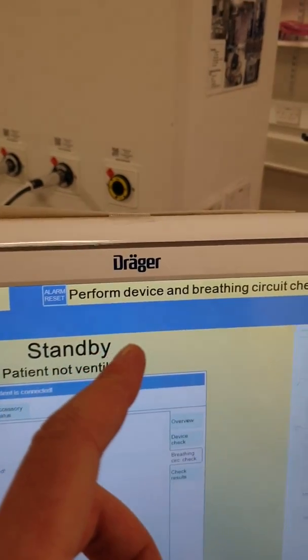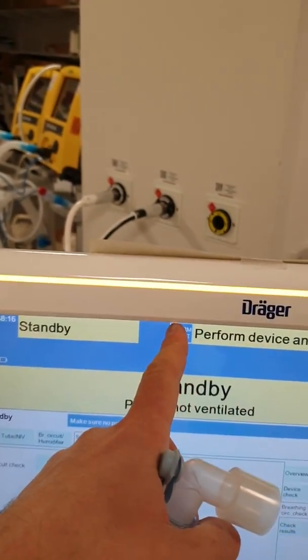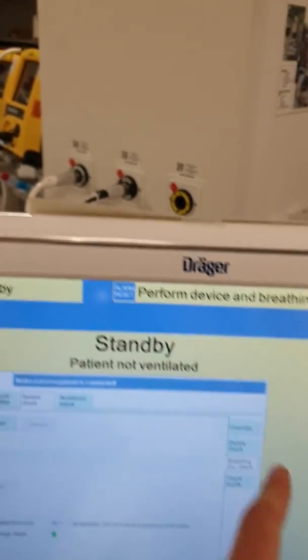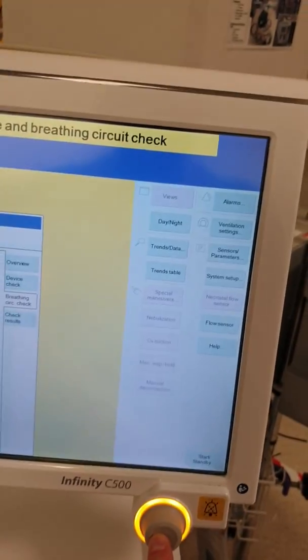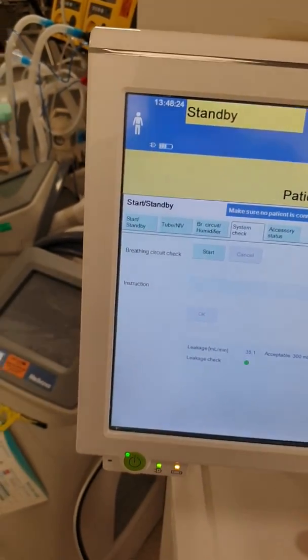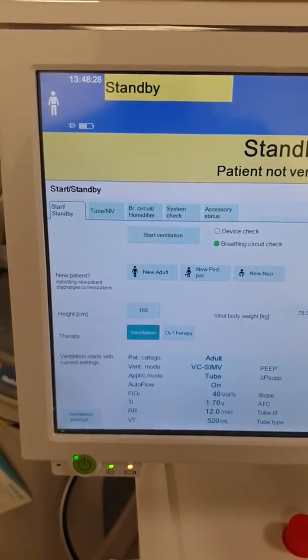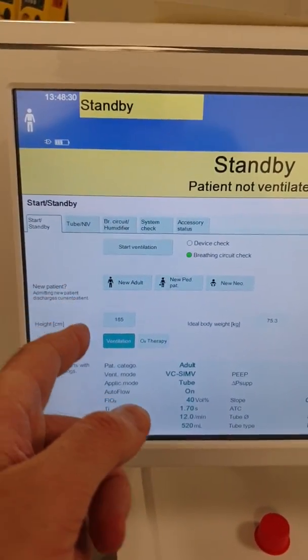Even if you have this alarm signal from the device and breathing circuit check, please ignore it for now. Press alarm reset and confirm it. So now to start the ventilator, you go to standby, and here you can start for a new adult or pediatric patient.